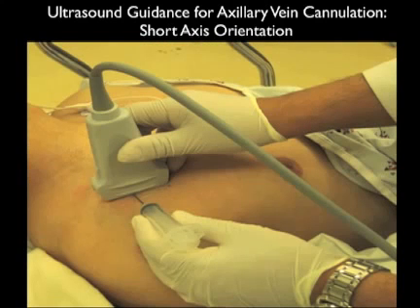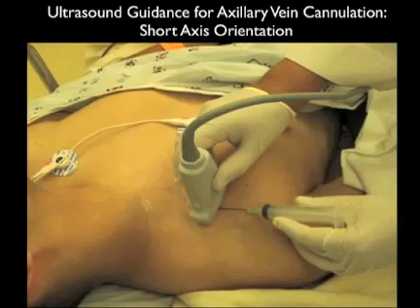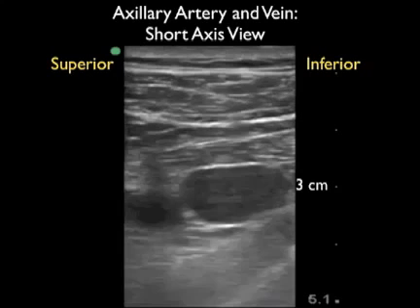Now there are some benefits of starting with this short axis orientation, namely that it's helpful in orienting the needle up or down, superior or inferior on the patient's chest wall to best aim it towards the axillary vein.